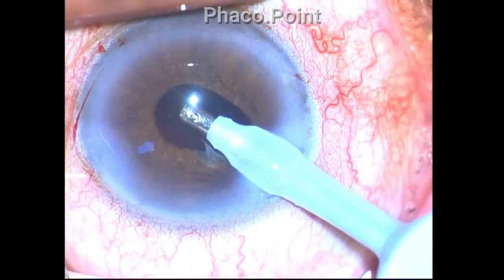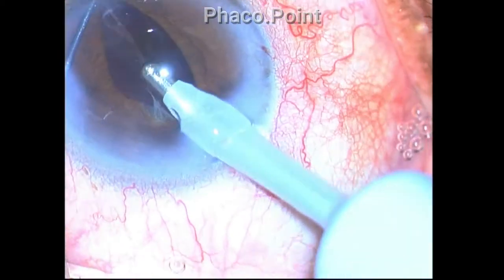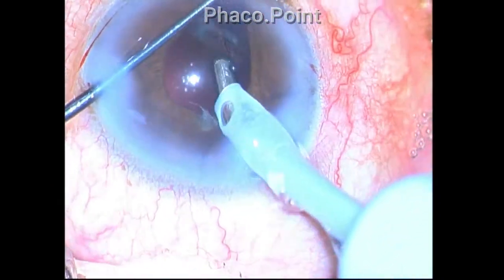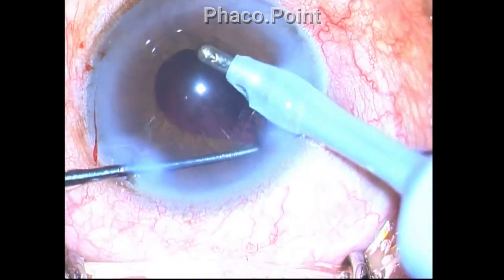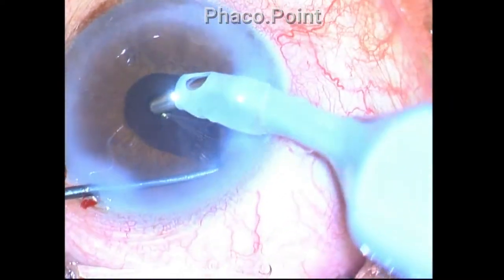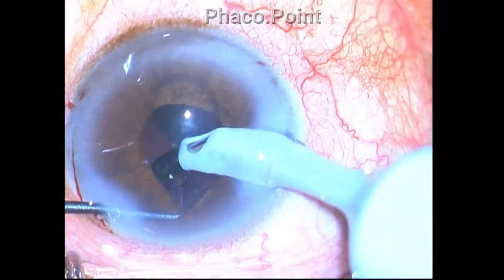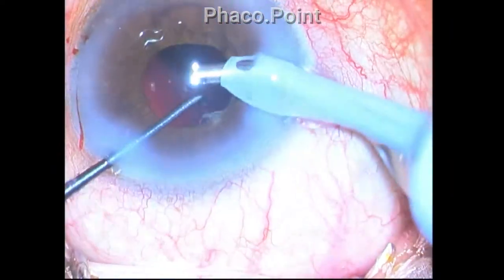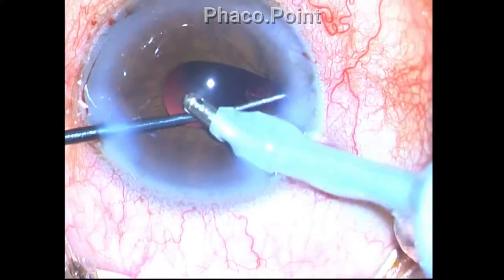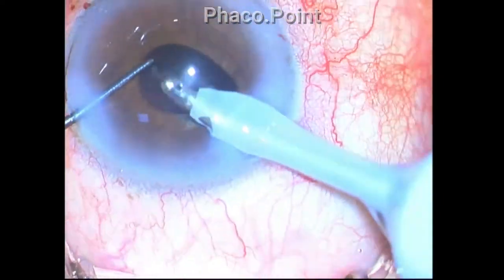I switch over to the ball dialer once again. The advantage of the ball dialer in cases of IFIS is that it helps to hold and push the edge of the pupillary margin away from the phaco probe — acting as a mechanical obstruction preventing the chafed iris from getting into the aspiration port of the coaxial IA cannula. This is why in cases of IFIS it is better to retract the iris using a ball dialer.